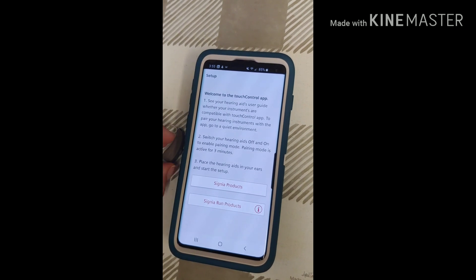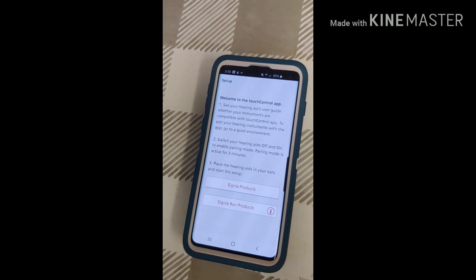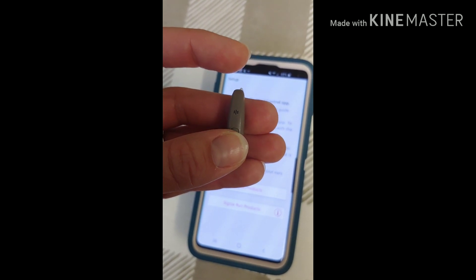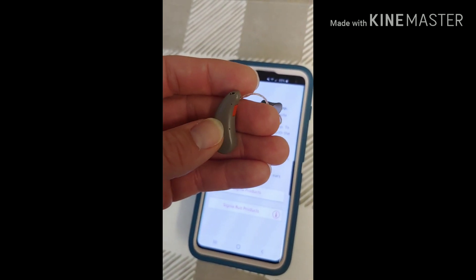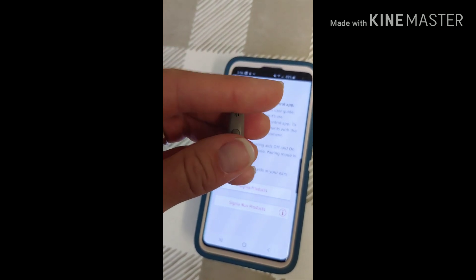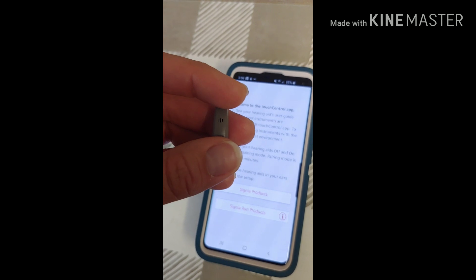Once you get to this screen, what you want to do is turn the device off and back on to put it into search mode. There are two different ways to do that. You can either press and hold the button on the back of the device for about five seconds to turn it off. You can also put it in the charger to turn it off. Once you take it out of the charger, it will automatically restart. Or you can press and hold the button again for five seconds to reboot the hearing aid.